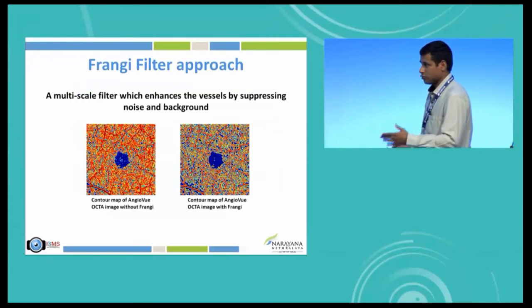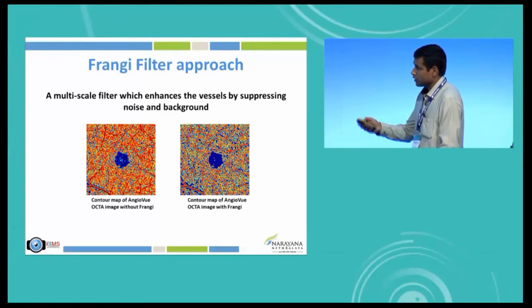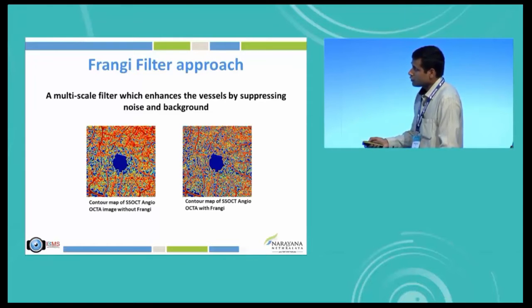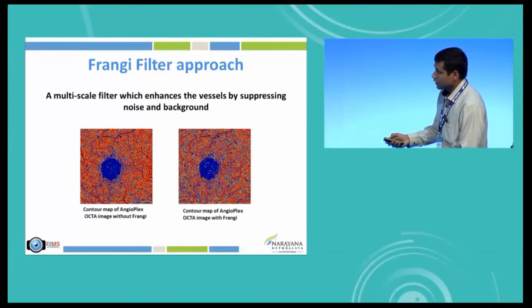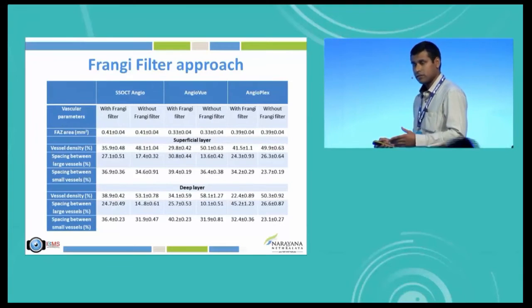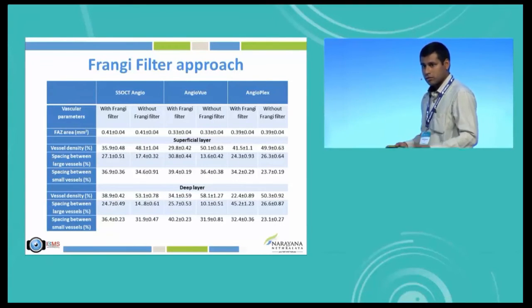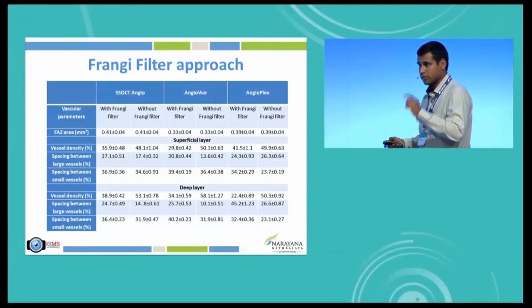A lot of discussion goes towards how well you segment the vessels, and we thought, why not apply one of the most commonly used vessel enhancement techniques, which is the Frangi filter. Using this, you can see how the vessel segmentation improves across the different machines by filtering and removing some of the noise in these images. Once we apply the Frangi filter, we do see a difference in the vessel density parameters, because the filtering technique allows you to segment the vessels out much better.